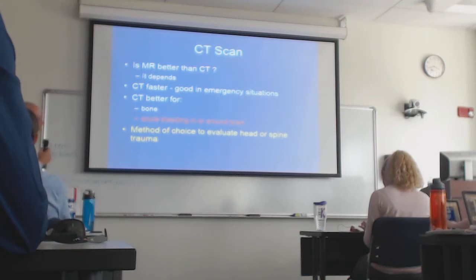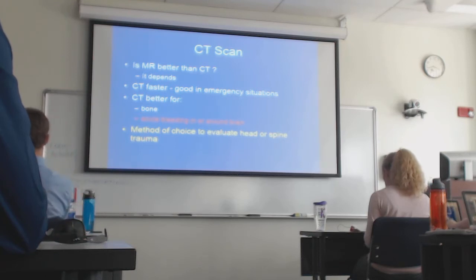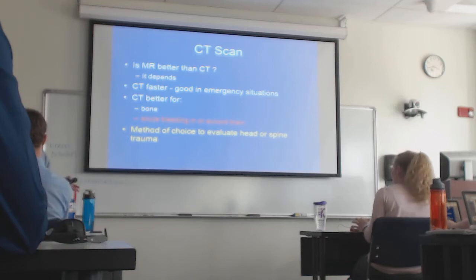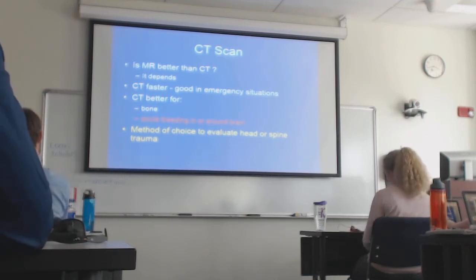So which is better? As I said, CT is faster, and it is the preferred method for emergency situations. CT is much better to evaluate the bones and for acute blood in the brain or around the brain. And CT is the method of choice to evaluate head trauma. So just about anybody who comes into the ER with headache, MVA, head trauma, fell down the stairs, just about anything related to the brain is going to get a head CT.